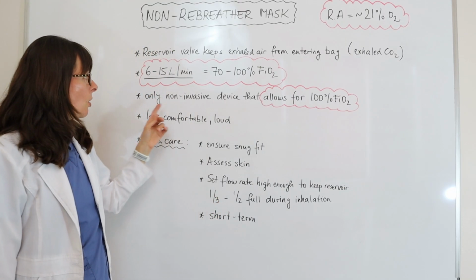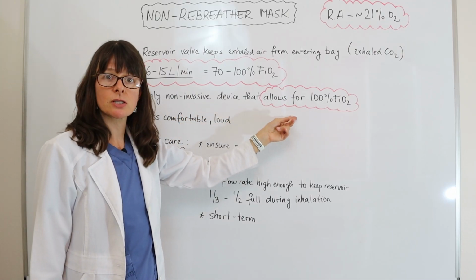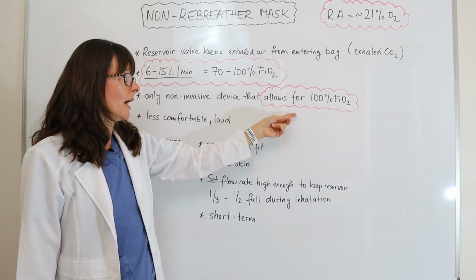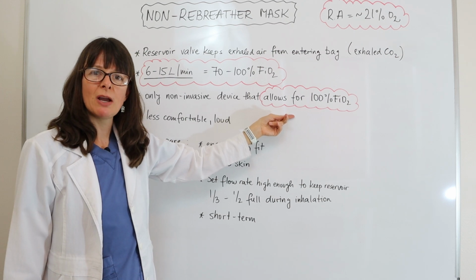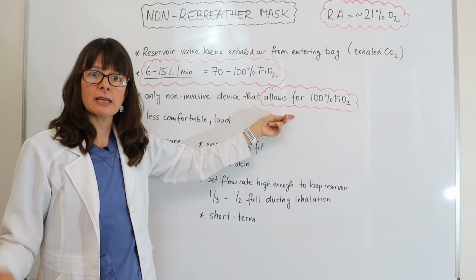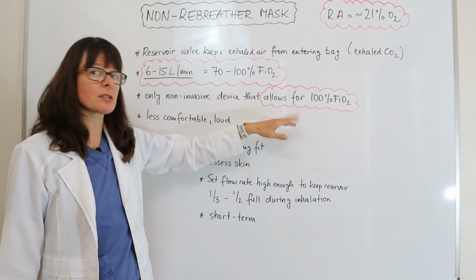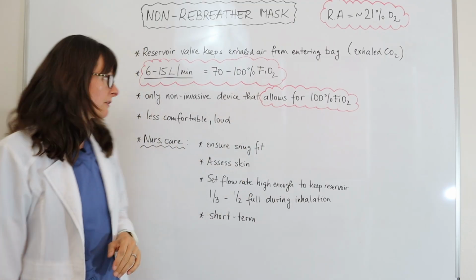And then it is the only non-invasive device that allows for the administration of the 100% FiO2. Other than that, we only have the endotracheal tube, where the patient actually has to have a tube inserted and have certain medications to keep them sedated. So this is the only device that allows us to administer 100% FiO2 non-invasively.